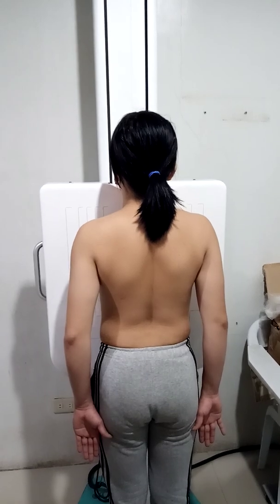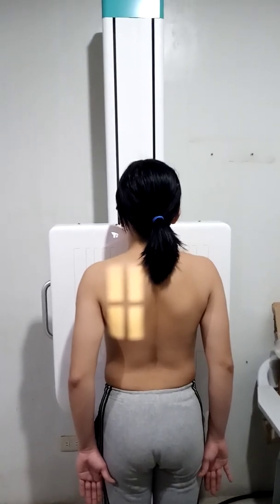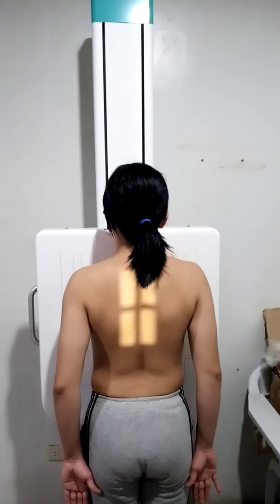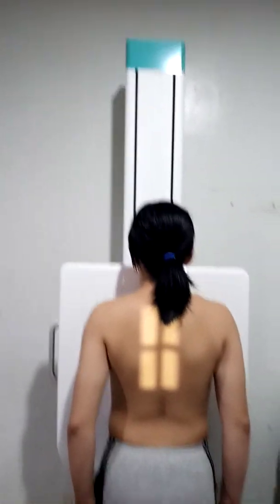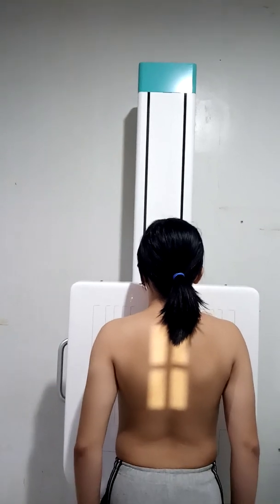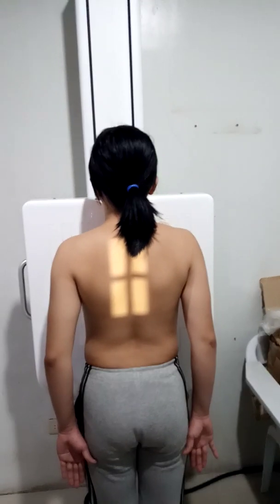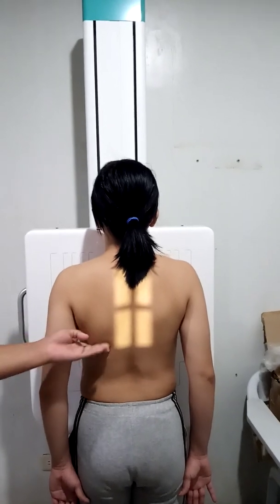Okay. The central ray must be perpendicular to the center of the IR. Must be centered to the IR. This directs the central ray at the level of thoracic 7, which you can palpate, or you can locate it by using the external landmark, which is the inferior angle of the scapula.